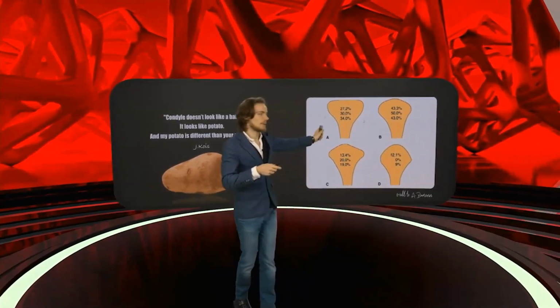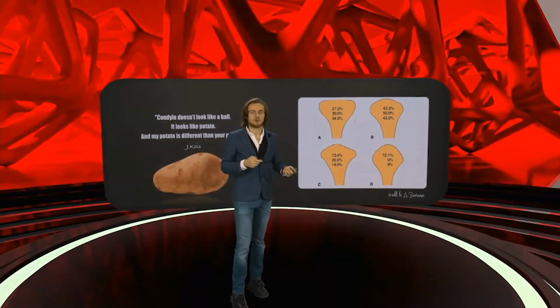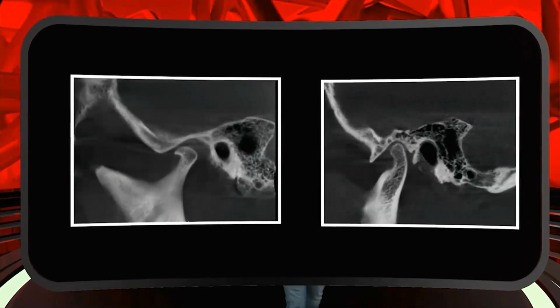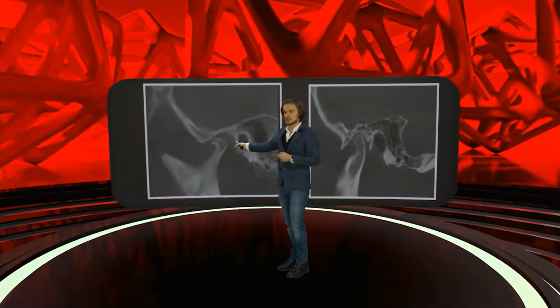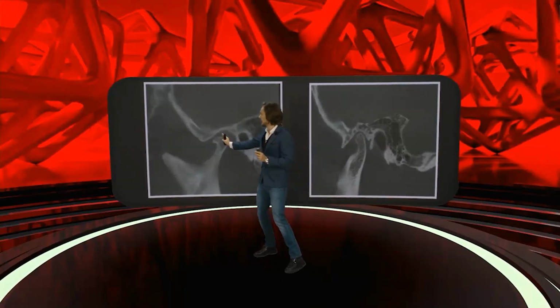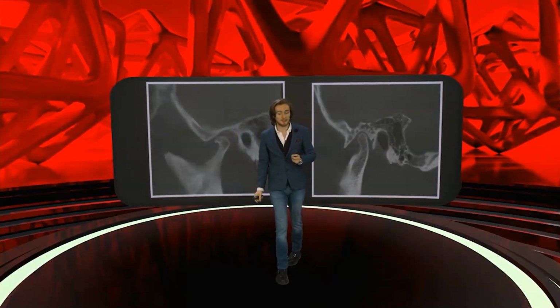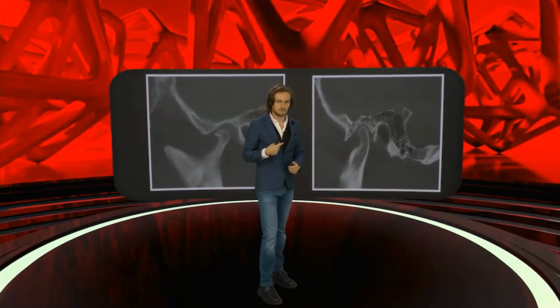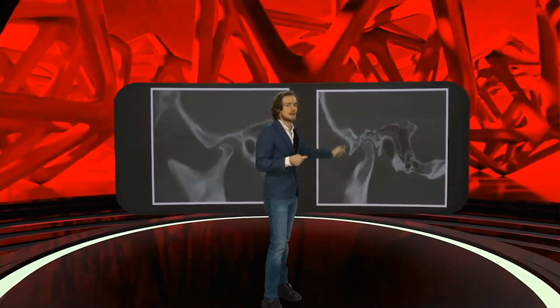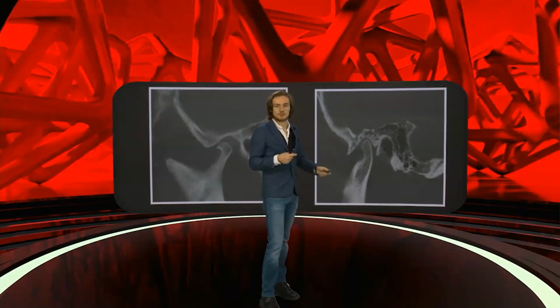So you see the variabilities of the condyle and statistics of those variabilities. You see that you can have different condyles and different fossae. One of them will be flat, one of them will be very steep. So when I look at this, and that would be my patient before splint therapy, I would rather expect him to go backward and upwards. So probably he would develop the anterior open bite after all, after stabilizing his condyle. When I look at this condyle, I think that the bite will not change significantly after splint therapy because it is already in the uppermost position.